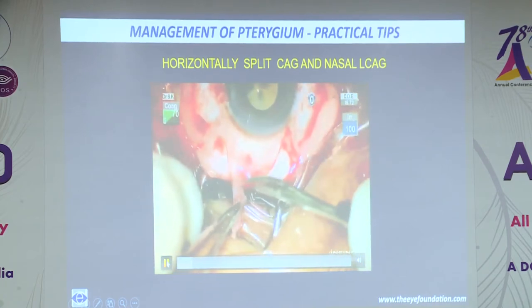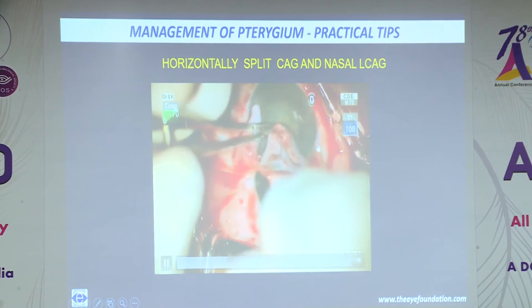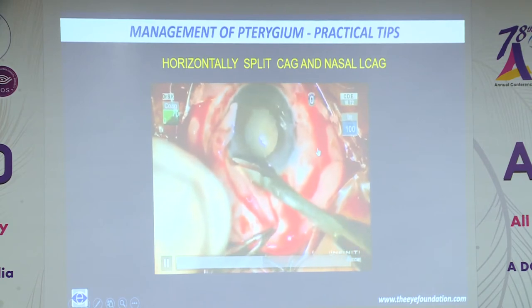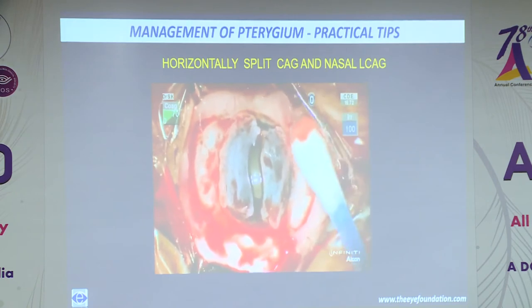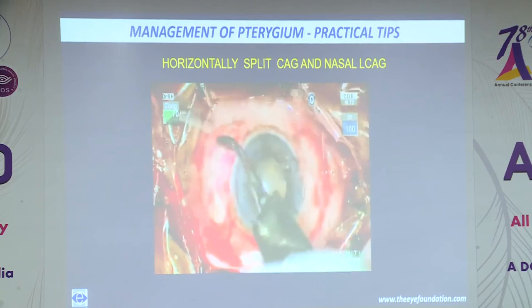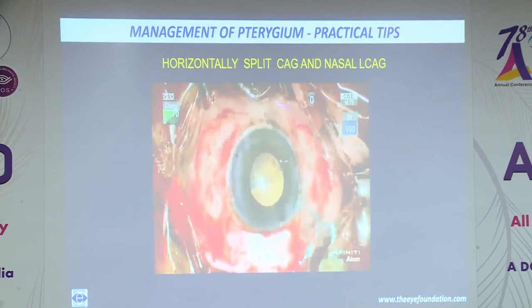And you can even split the graft horizontally if you have to resurface a large area. You can see here is a large defect on either side. You can split the graft into two parts horizontally and place the graft. I'm just taking a thin limbal block of tissue from the peripheral cornea, because the nasal pterygium was a recurrent pterygium. I thought including a thin block of limbal tissue will prevent recurrence. Of course, there's not much difference between a simple conjunctival autograft and a simple limbal conjunctival autograft.